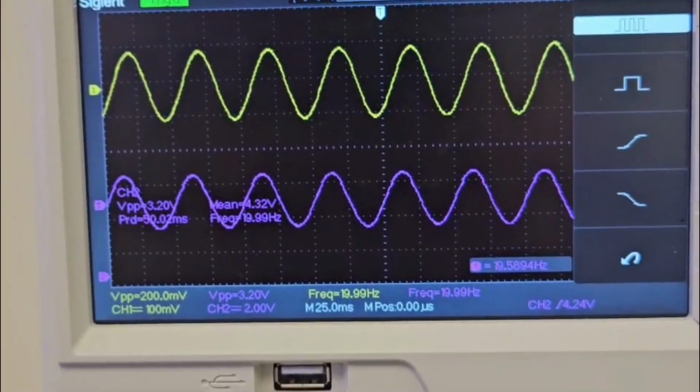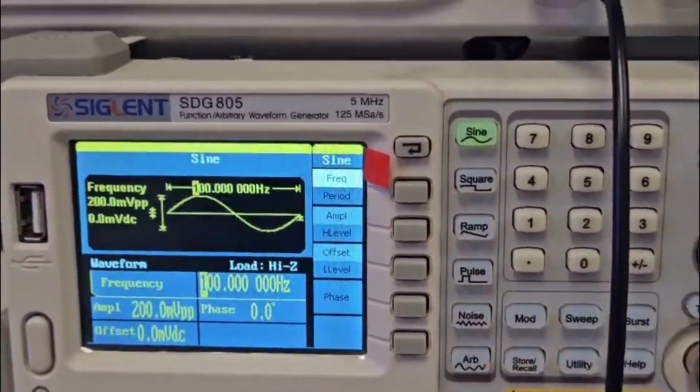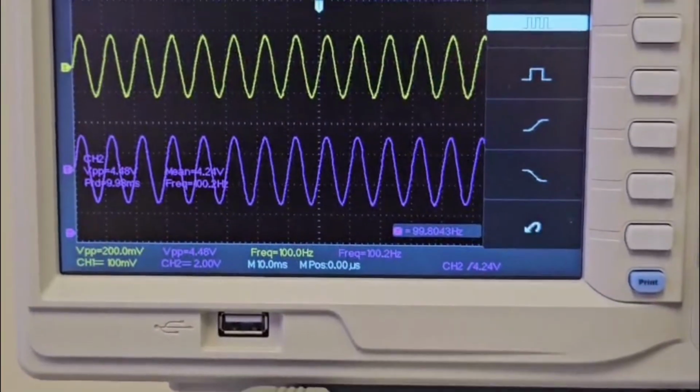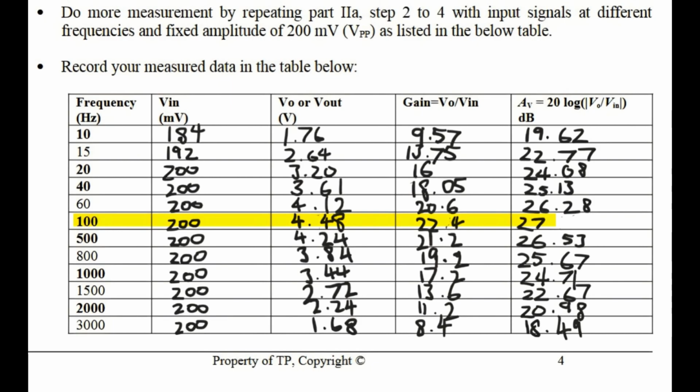Then I will change the frequency to 100 Hz. And now my V out changes to 4.48 volts. This gives us a gain of 22.4, which is very close to the calculated gain of 23. And the AV here is 27 decibels. And in the table below, it shows other frequencies recorded so that I can plot the graph.